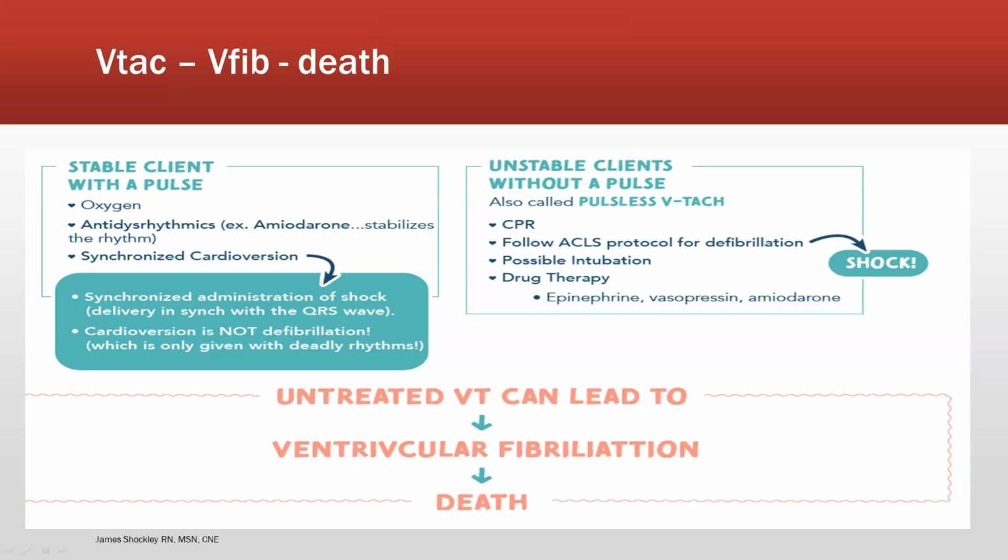So, VTAC, VFib, all the way to death. And so if I have a stable client with a pulse, I can cardiovert. Synchronized cardioversion just means we hook it up to your heart. It senses what your heart is doing, and it delivers a shock at the appropriate time.